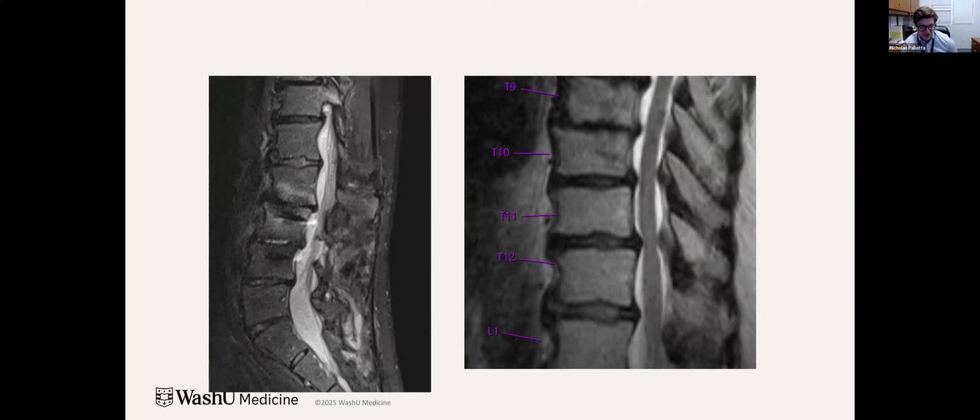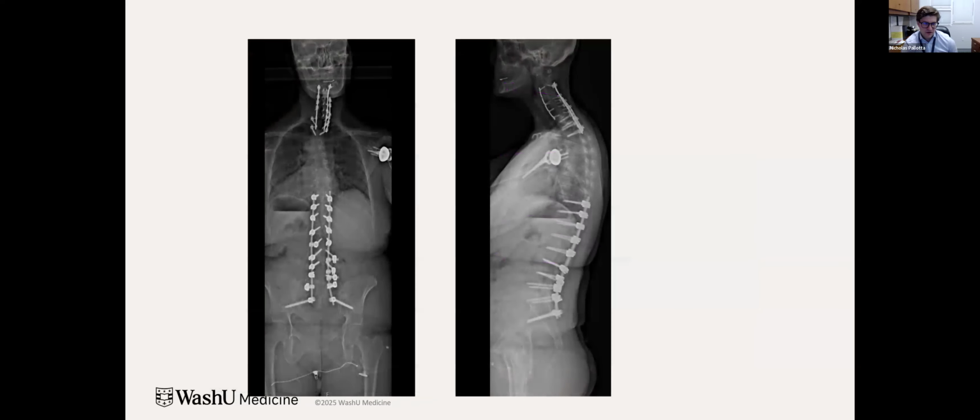And so again, another one of these choices. I really didn't want to connect her cervical thoracic construct to the lumbar spine, although we did talk about it. We talked about leaving the thoracic stenosis alone because she wasn't symptomatic, but ultimately decided to cover that so that she didn't become symptomatic from it.